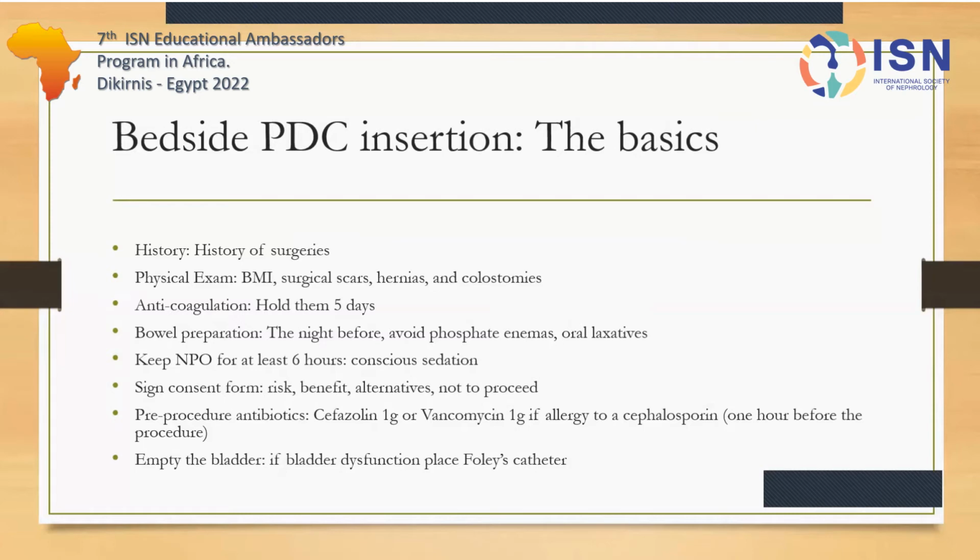Some patients can be on blood thinners, anticoagulation, commonly for cardiac reasons, and in that situation, before you proceed, you would like to stop them for at least 5 days, unless this is an urgent start of PD. Bowel preparation, important practice.